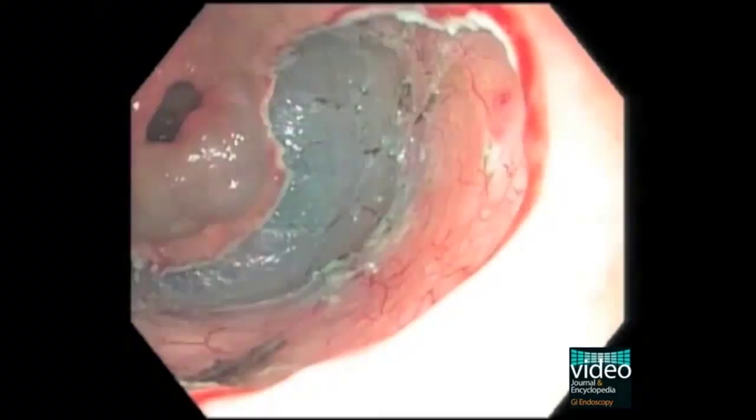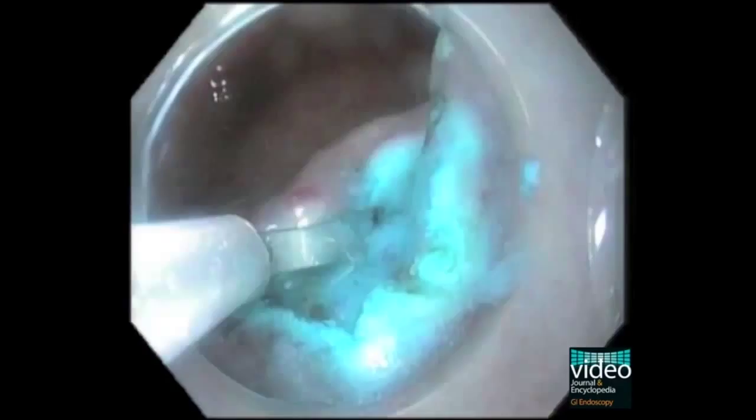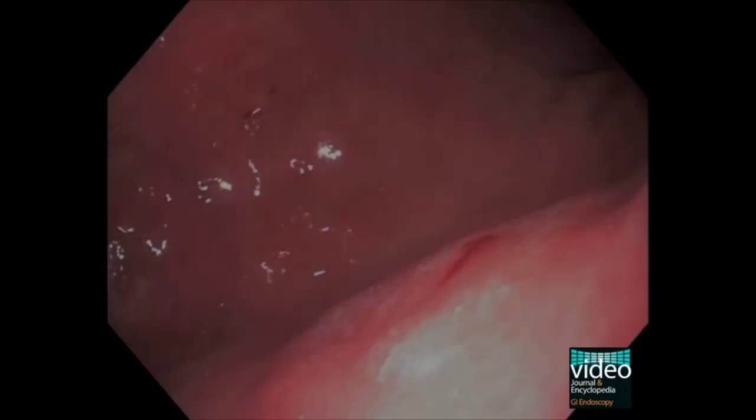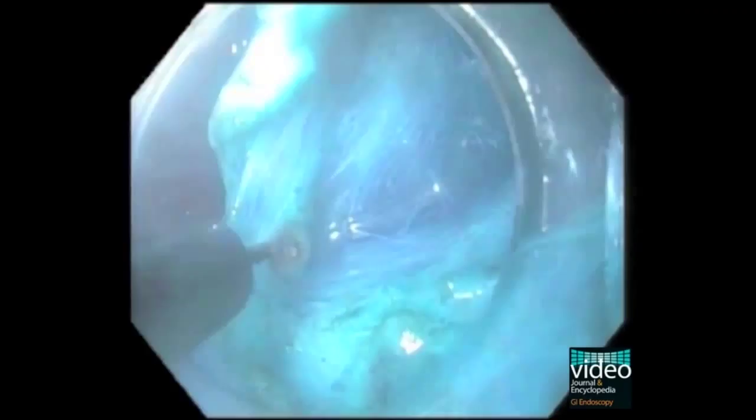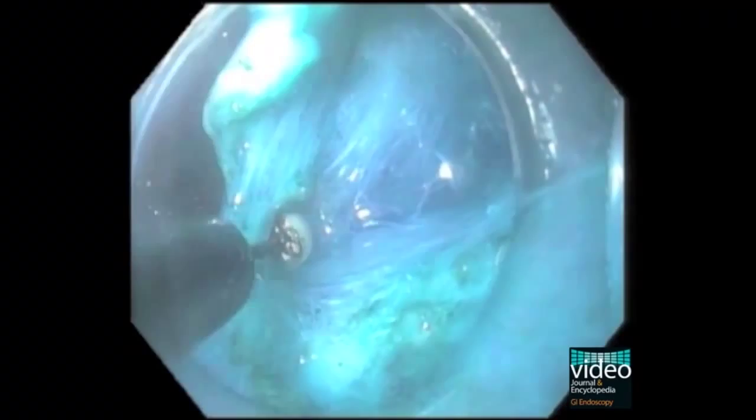In this last case, the access to the submucosal space was difficult due to localization of the dysplastic lesion in the antrum posterior wall. Pushing the snare, the submucosa becomes evident, exposing the dissection plane and enabling precise dissection.